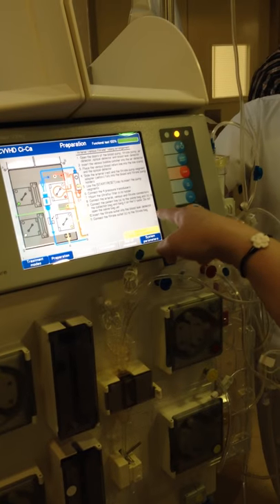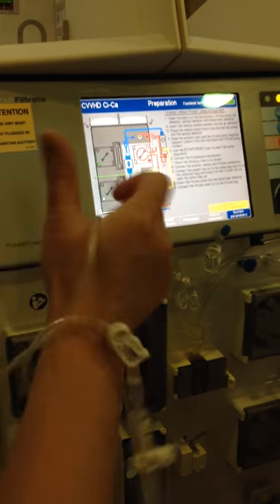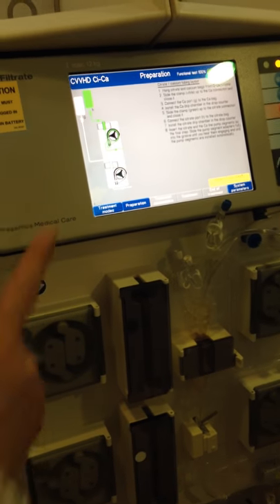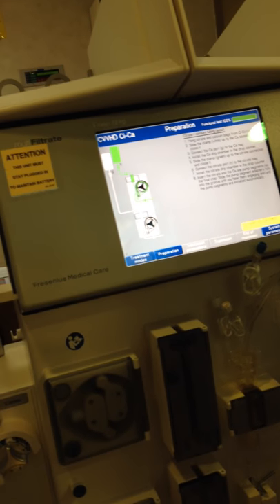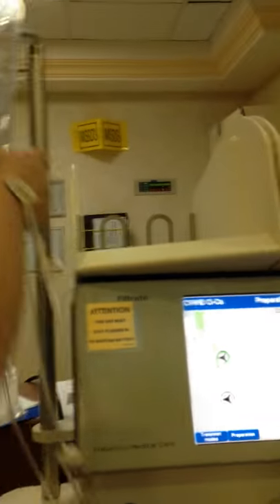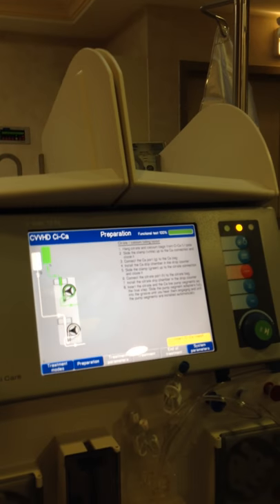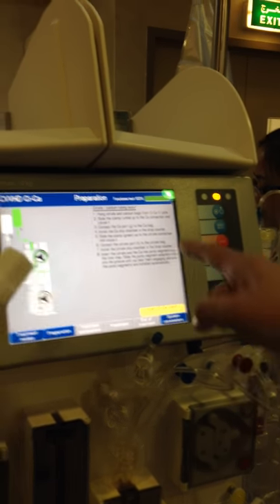I'll tell you exactly why. Connect the filtrate. Insert it. Hang citrate and calcium bag. You have to understand that citrate comes in a different bag, okay? Citrate has to be placed, which color? Green. So green should be in the front. Let's say, for example, our calcium is this one. Give me a 500cc bag.